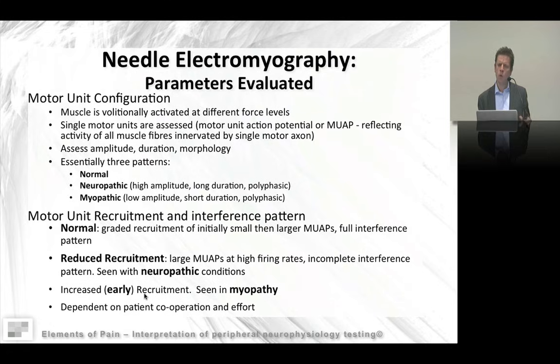Recruitment and the interference pattern analysis is really dependent on effort. Spontaneous activity is usually well tolerated by patients, but with the needle in a moving muscle, that's where they tend to have problems.